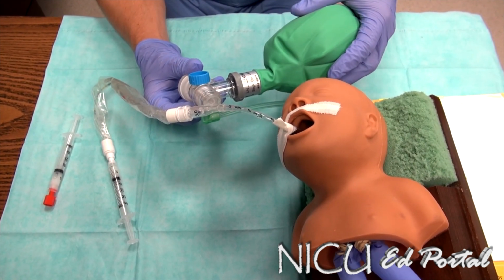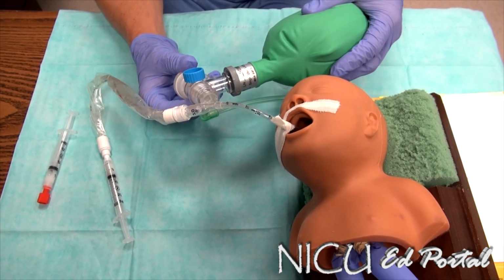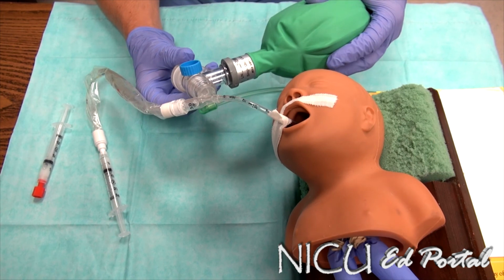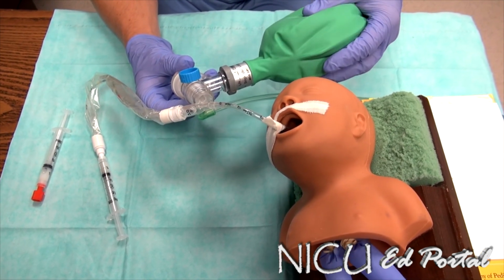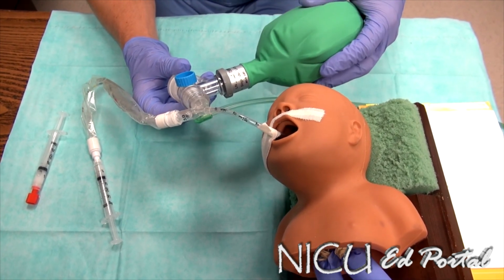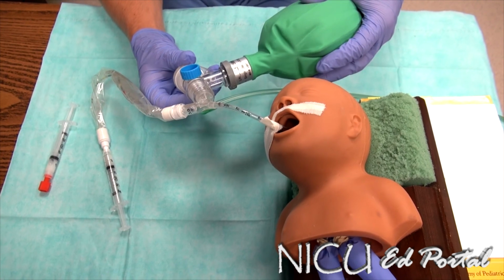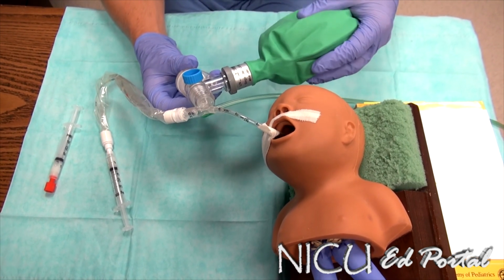Prior to administration of the first aliquot, things to consider: making sure the baby is stable, vital signs, saturation, heart rate. Also, after intubation, listen for bilateral breath sounds, making sure the tube is in proper placement as well. So prior to administration, bag at a normal rate. Prior to administration of the surfactant, and then after, we might bag at a little faster pace.